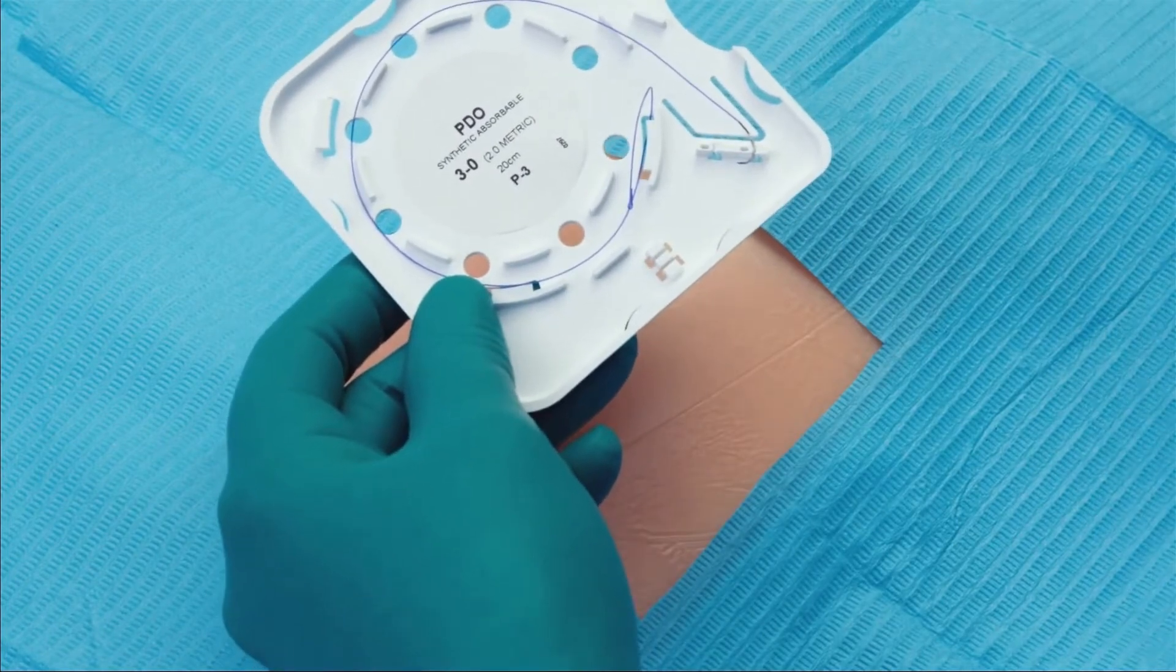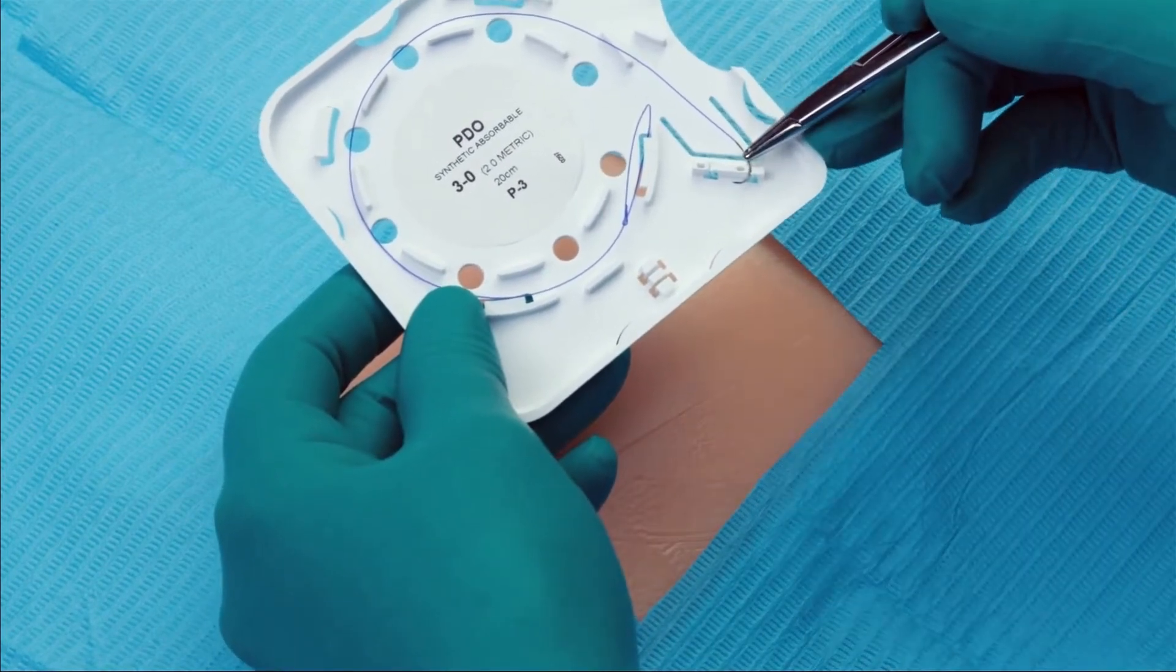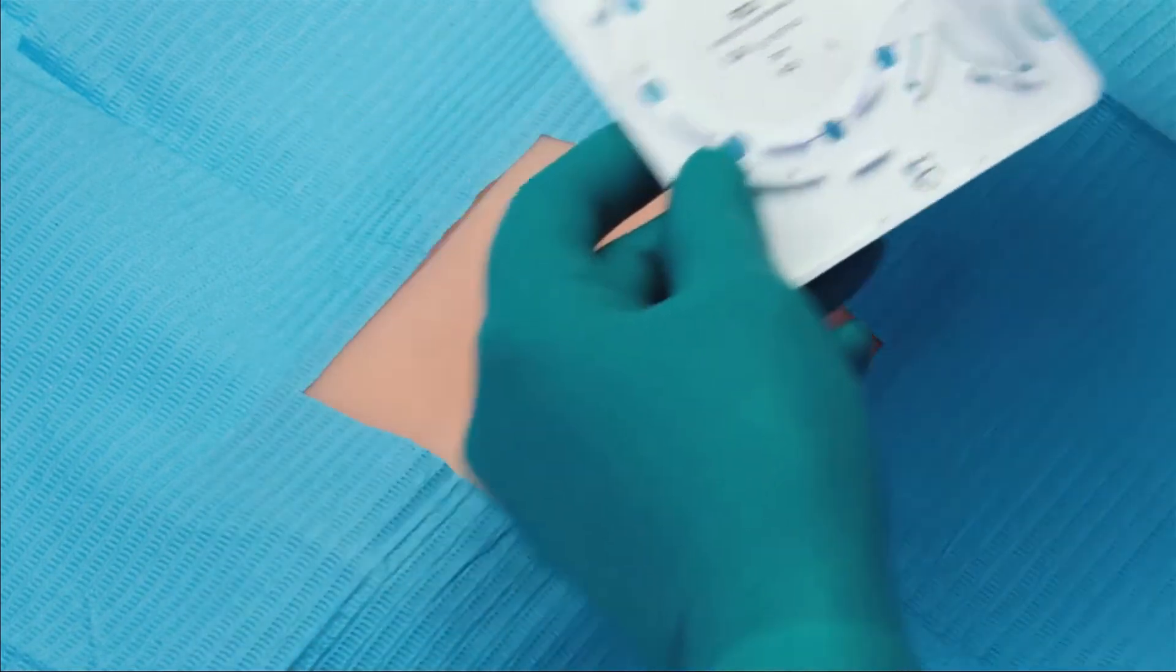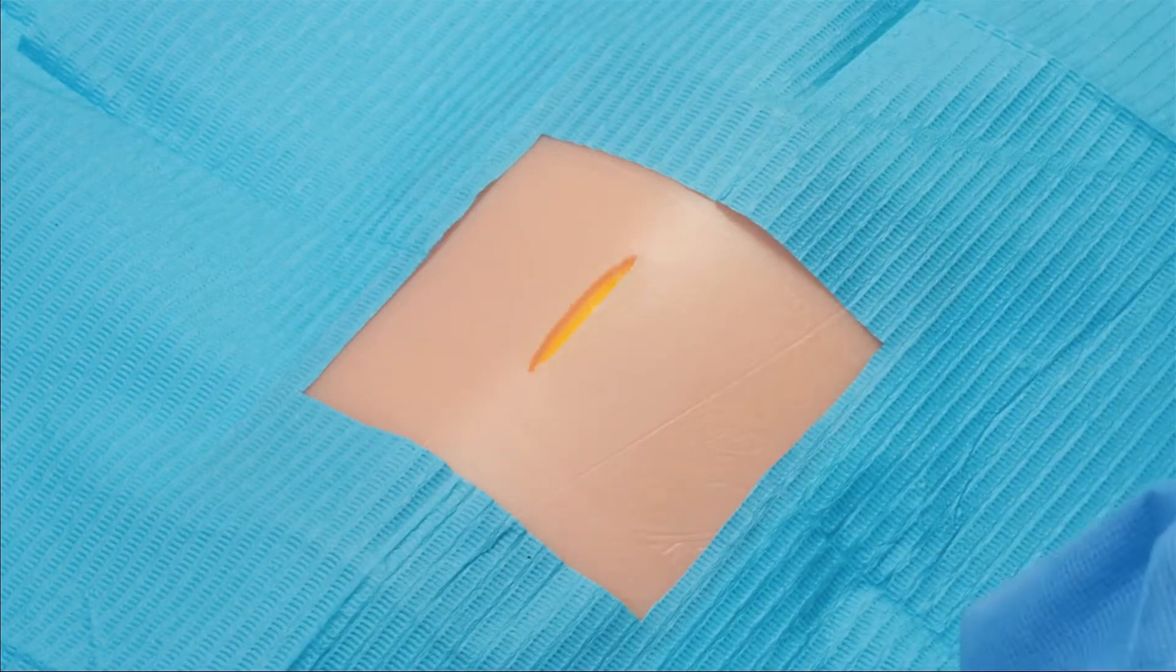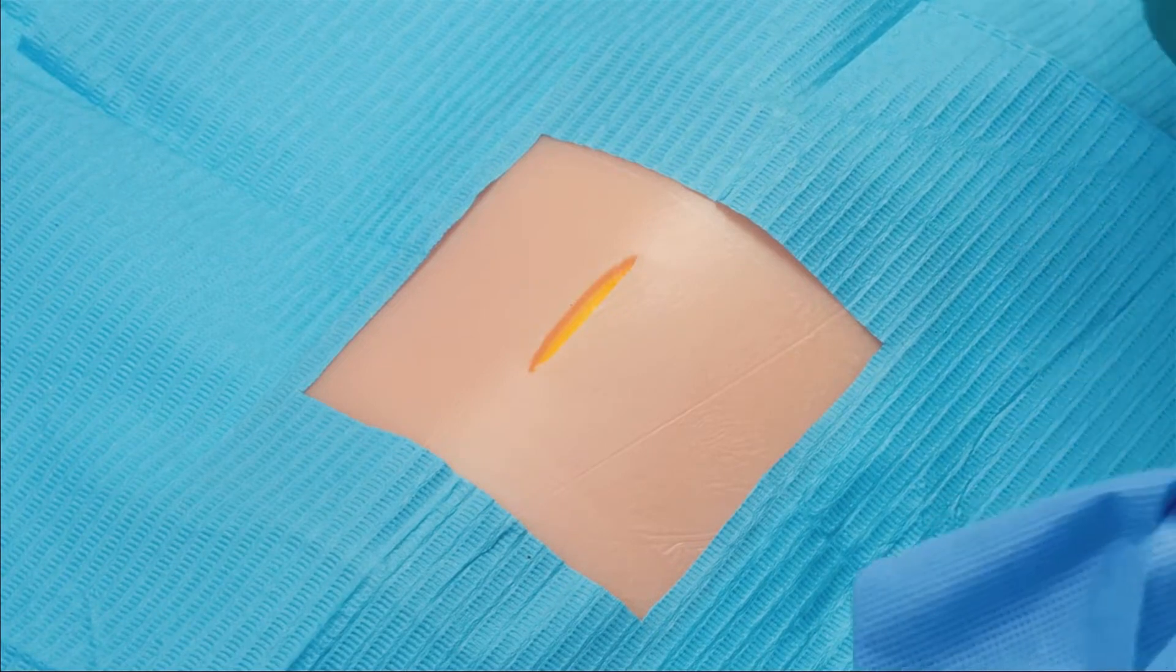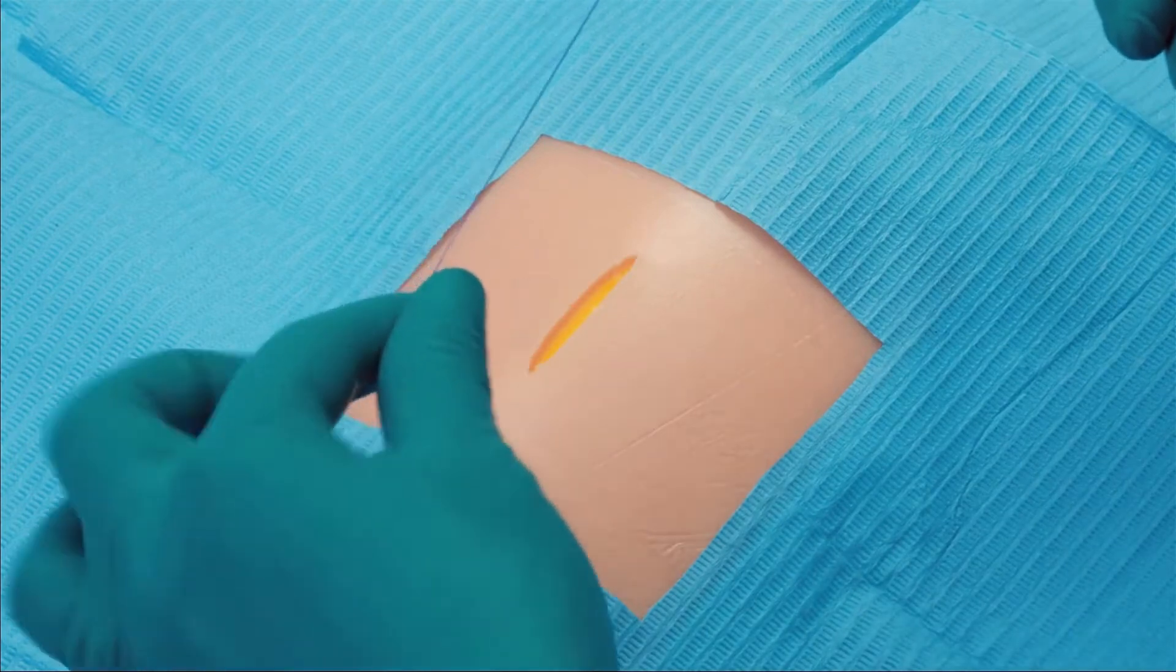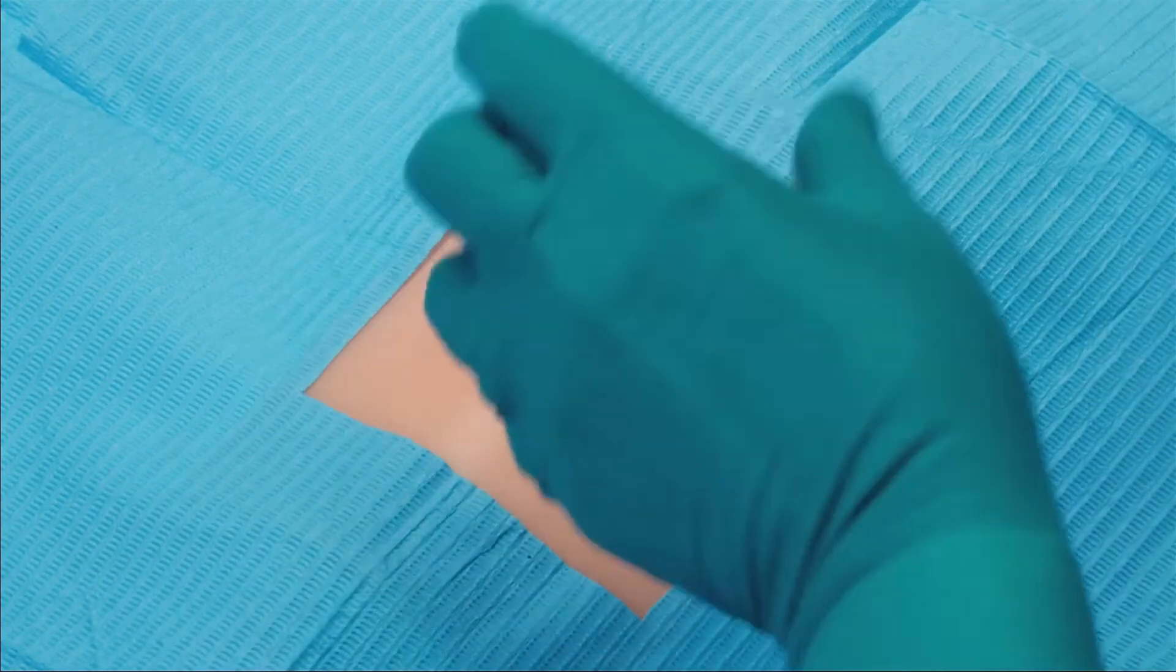We have the needle here, and a little loop. Here, we are looking at a surgical defect after excision. We will be approximating the deep dermal layer with a quill device.